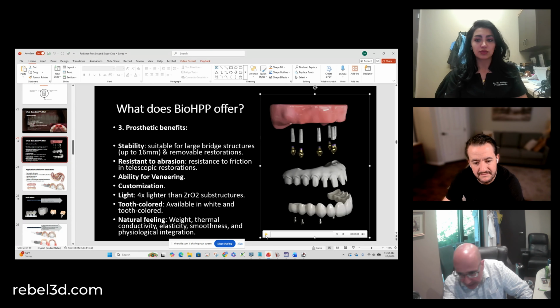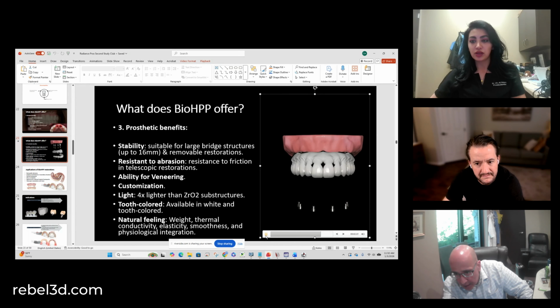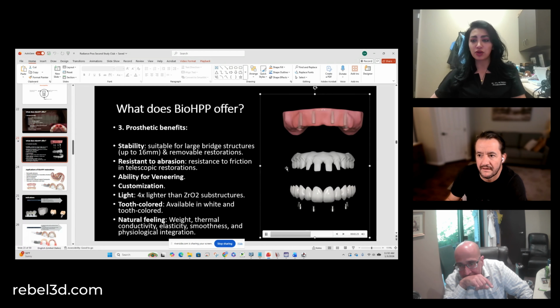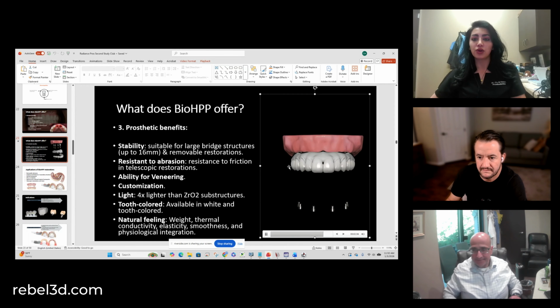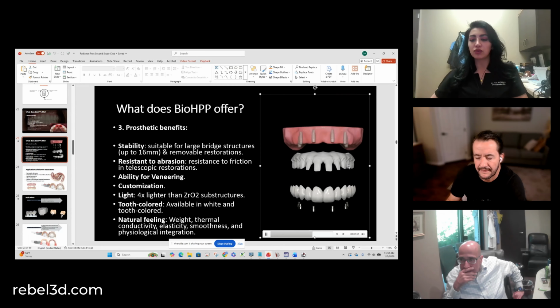Here is how it looks. So you see the thimble design? You can also design it as an eye-bar and design the zirconia sleeve on top. But this is the design of choice because it's easier for long-term maintenance in case you need to replace one or a few crowns.